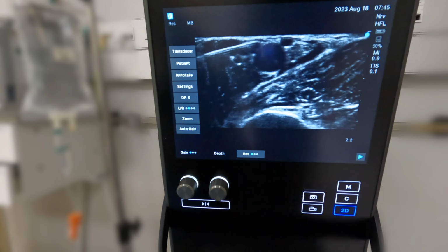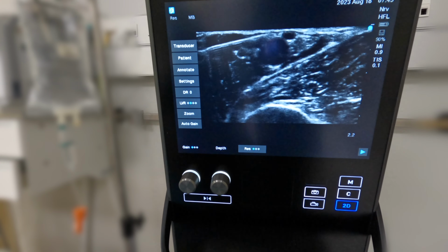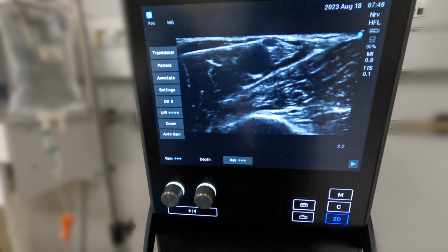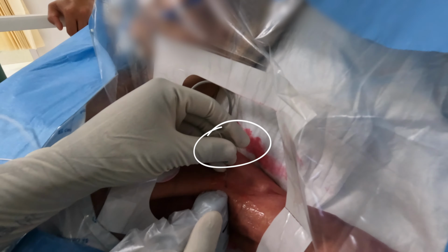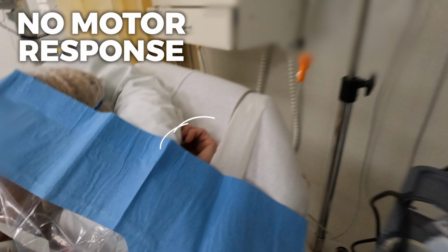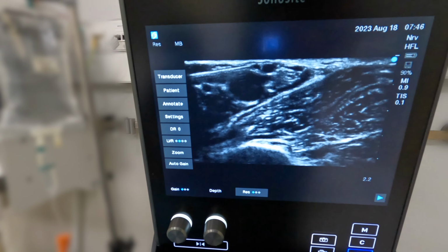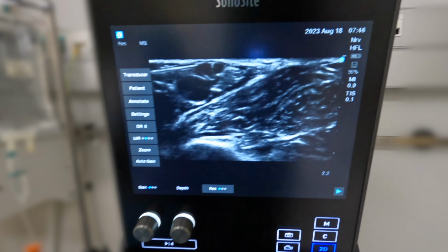Okay. Continue advancing the needle. Now you should feel a pop as you enter the main sheath. That was it. Yeah. Pull back. Stay there. Okay. Aspiration negative. Okay. Yeah. Twitch absent. 1 cc. Give again, please. Thank you. There you go.